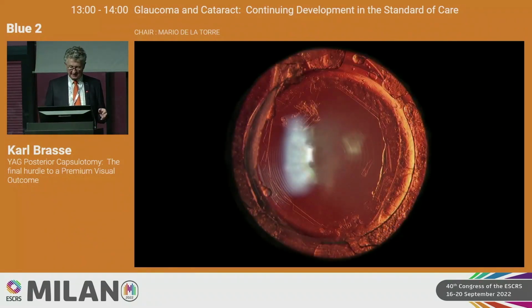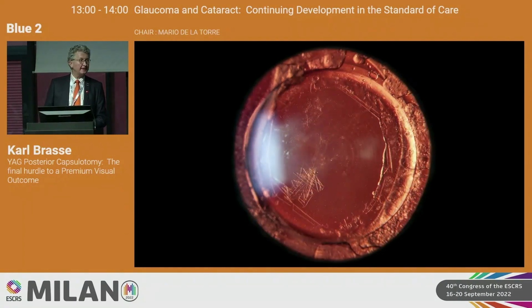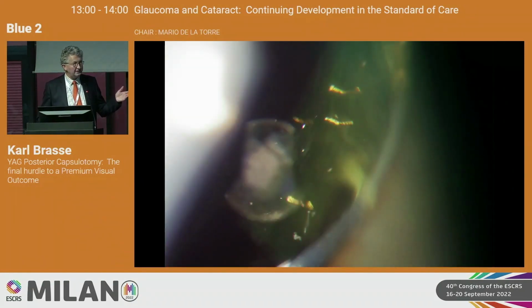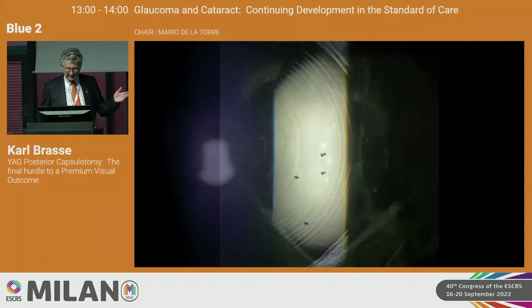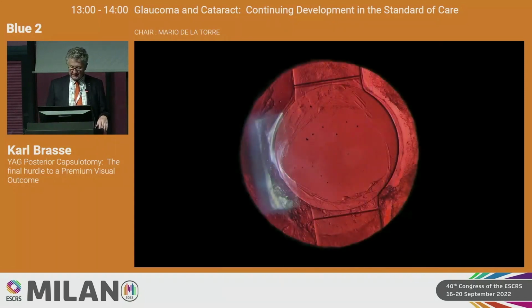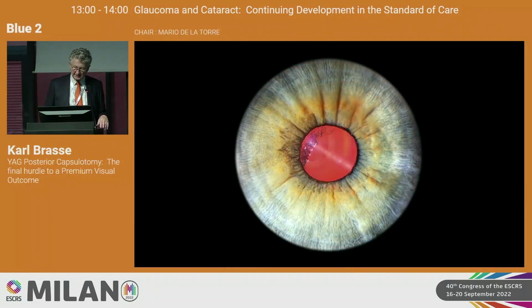These are court cases. This is, for instance, a floater that was done with a circular technique, which can be extremely annoying to patients. And here in particular, you see cases where a contact lens was not used. I don't call that pits, I call that drills. You create drills through the entire IOL. And I think in these days, where everybody uses digital photography, you might end up in a court case with poor work like this. But you can avoid it easily.